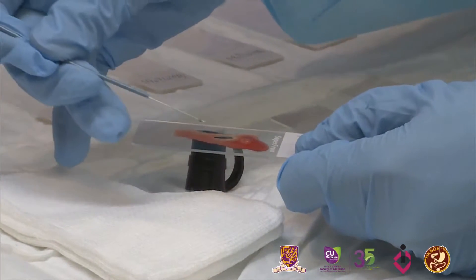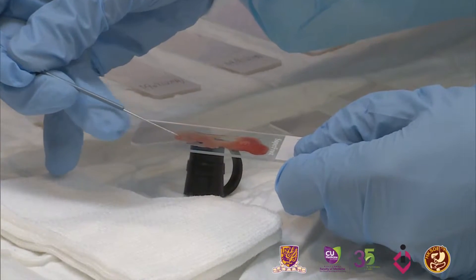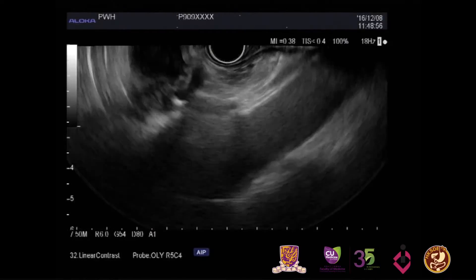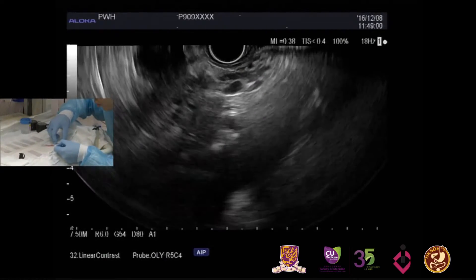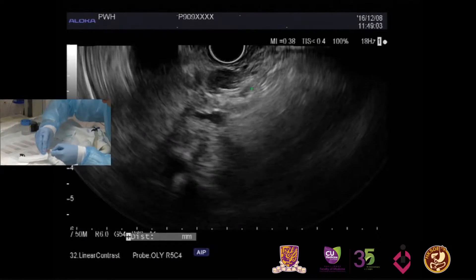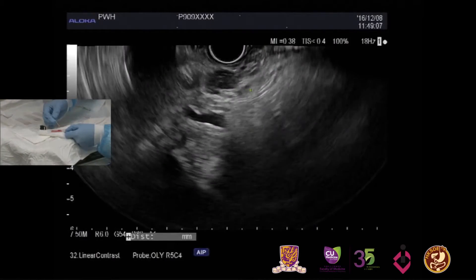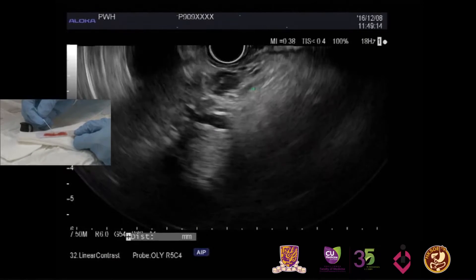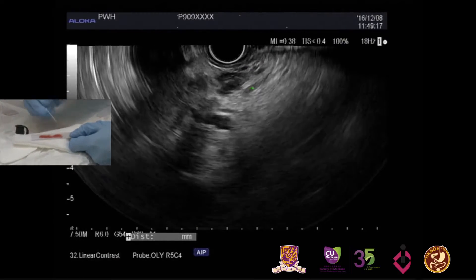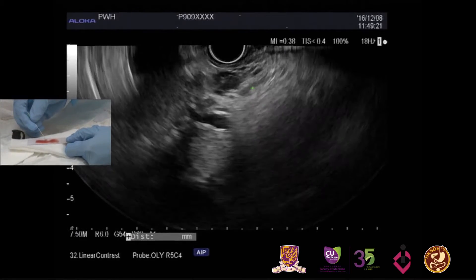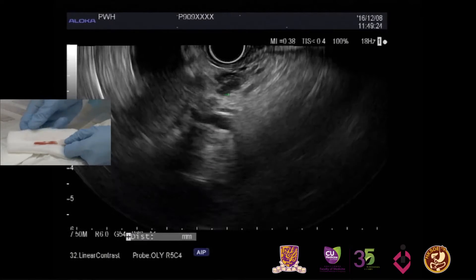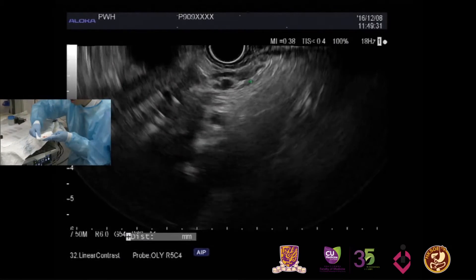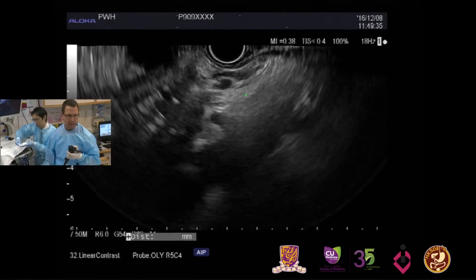Unfortunately, it is involving the arteries, so I don't think this is currently resectable, which likely explains the patient's pain. An interesting finding: if you look at the region of the celiac plexus, you can see this dark tissue — this is actually the celiac ganglion. We often see this in patients with malignant infiltration. If we biopsied that, we would get neural tissue with likely tumor invasion. I think this tumor is actually invading right up the neural sheath and into the celiac ganglion. We will target our celiac plexus neurolysis to this region after the FNA.